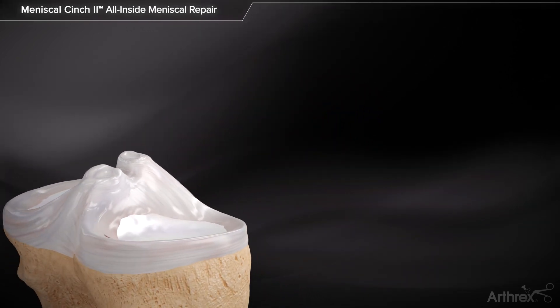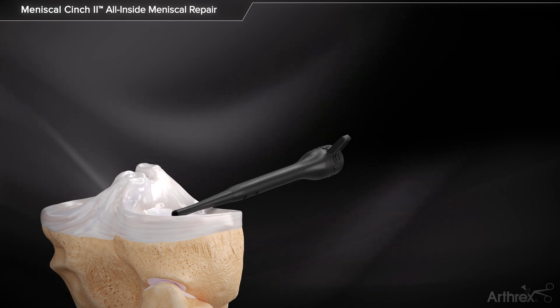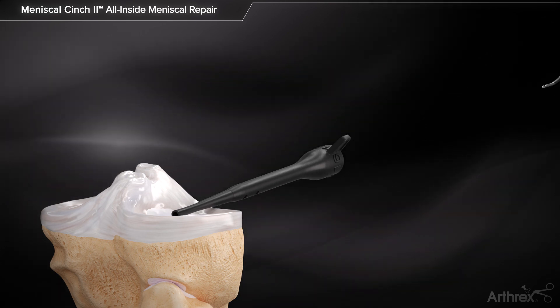The Meniscal Cinch 2 Implant Delivery Device for all-inside meniscal repair delivers small peak implants, which are secured by 2.0 FiberWire Suture.